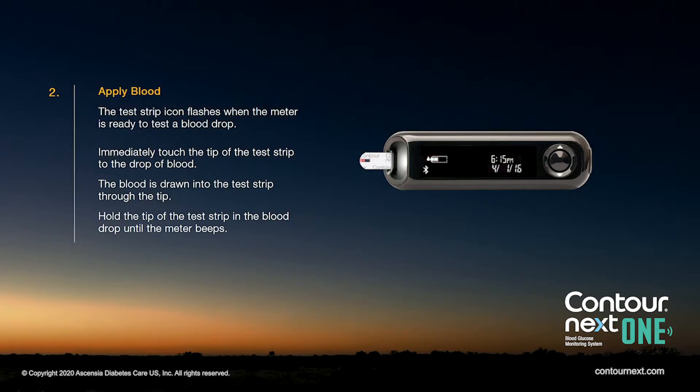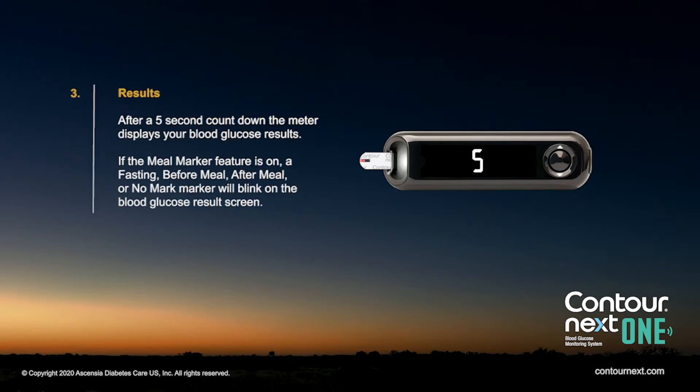The test strip icon flashes when the meter is ready to test a blood drop. Immediately touch the tip of the test strip to the drop of blood. The blood is drawn into the test strip through the tip. The meter will beep once complete. After a five-second countdown, the meter displays your blood glucose result.